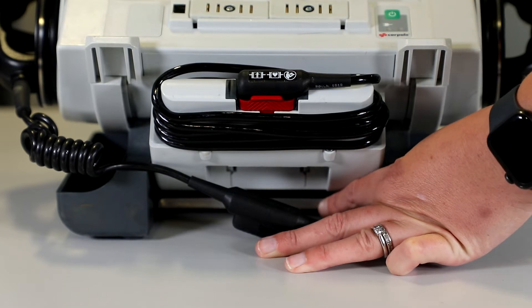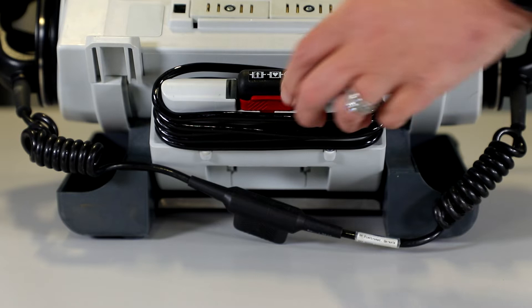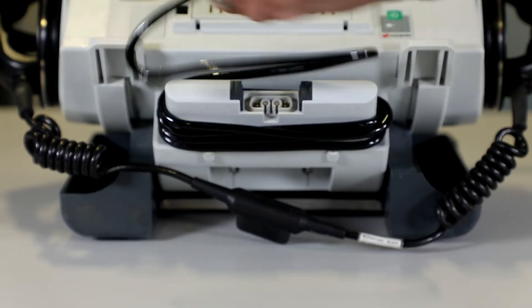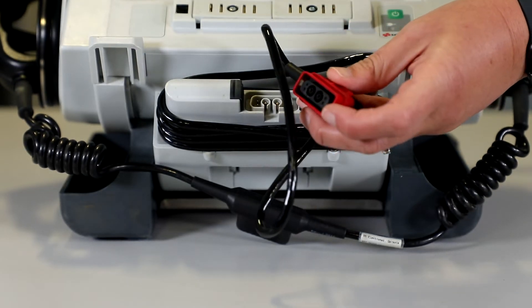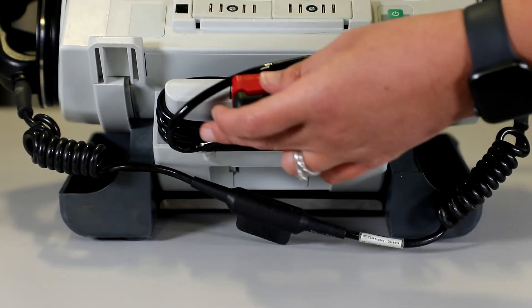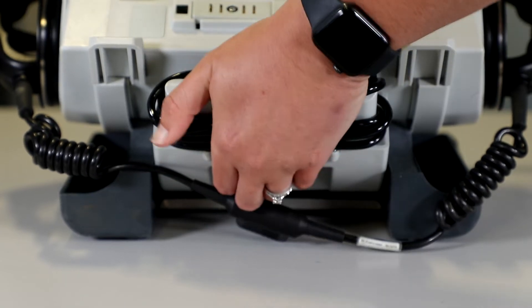Once we're happy with that, the next thing is to check the therapy master cable. To do this we squeeze and remove it like so. We're looking for any damage and checking that the two white clips are there. Then just having a look for any dirt, damage, or anything untoward, and we apply it back in like so.